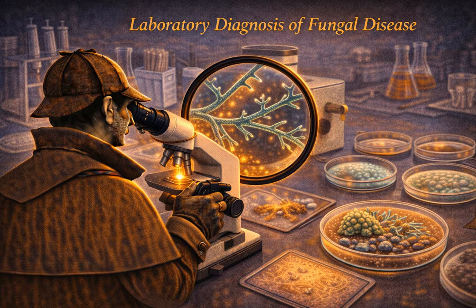We used to use the India ink stain to look for the clear capsule halo under a microscope, but India ink is highly insensitive. It literally misses about 50% of cases. And the CrAg test.